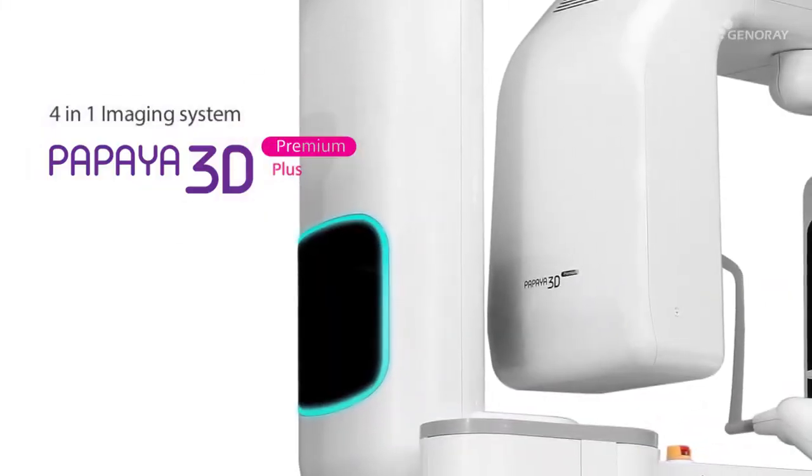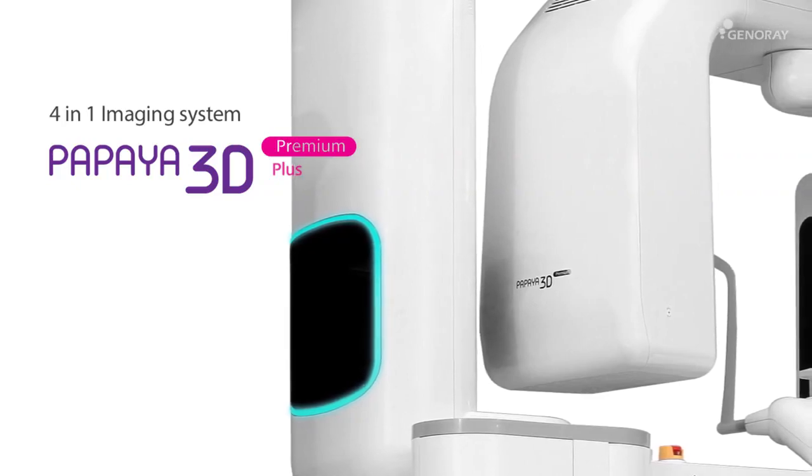This video is for how to use the Papaya 3D Premium, a combination imaging system.